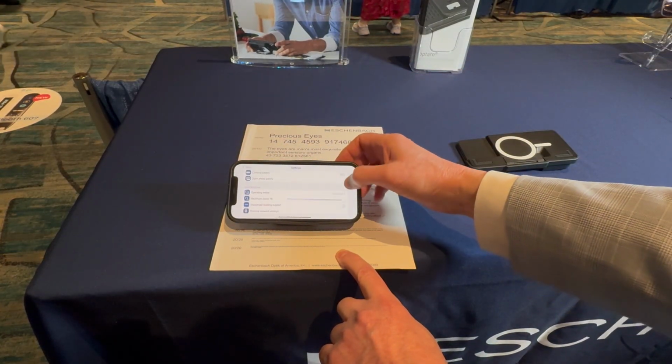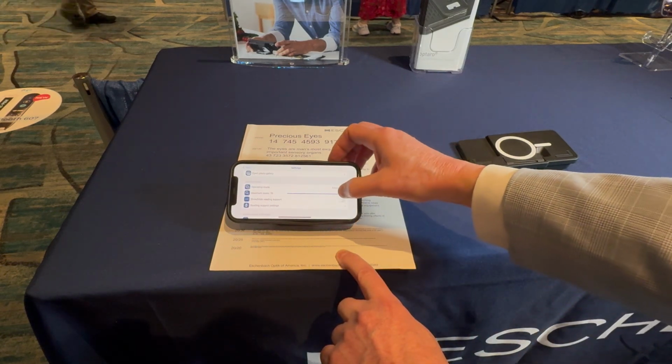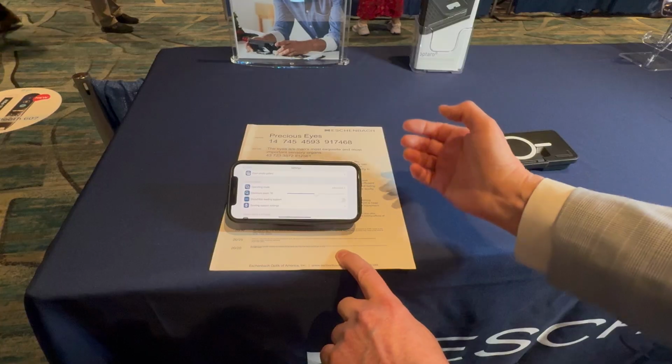You can also change the maximum magnification zoom. So it's set for 15 now, but maybe the person doesn't ever need to go up that high, and you can stop it at 10x.